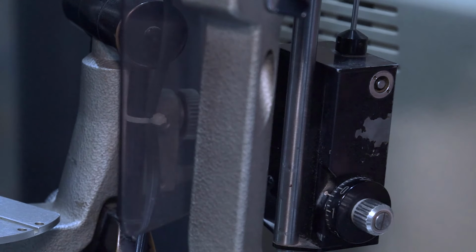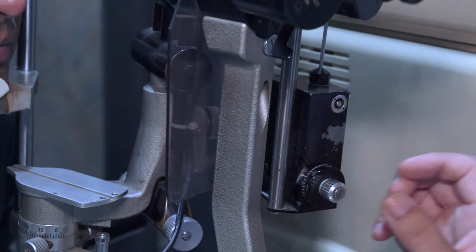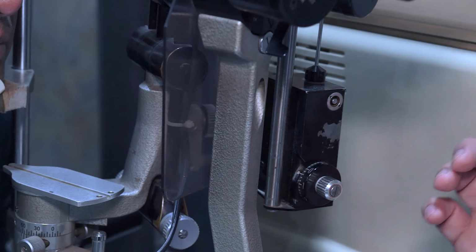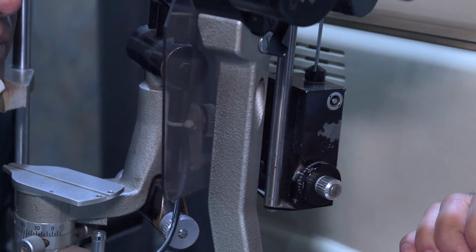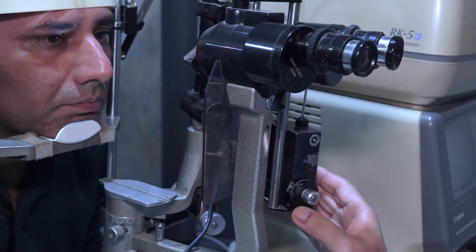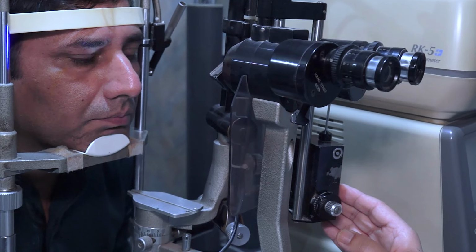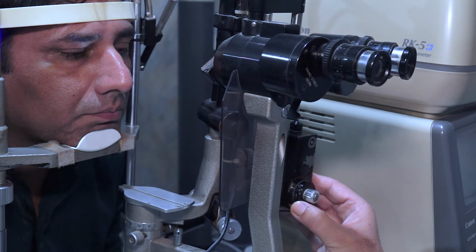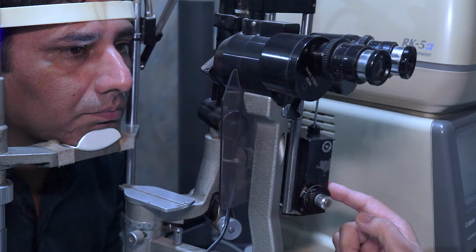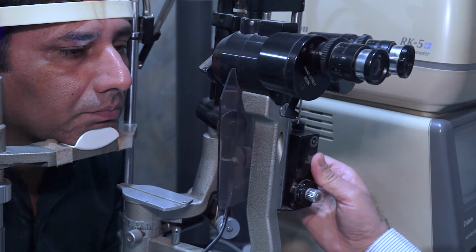When these two broken rings coincide, their inner edges coincide with each other, then this means that this is the actual intraocular pressure of the patient. And then we read the intraocular pressure directly on this Goldmann tonometer dial over there, as we have done in this patient.